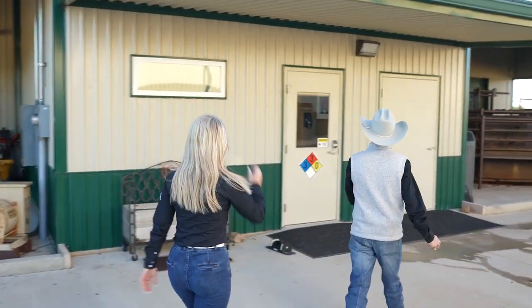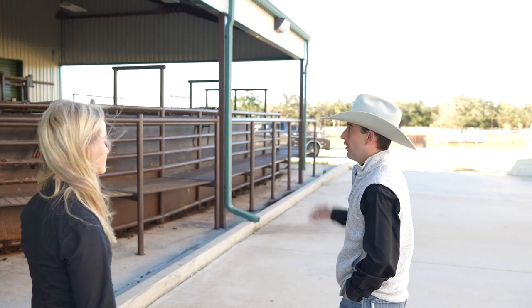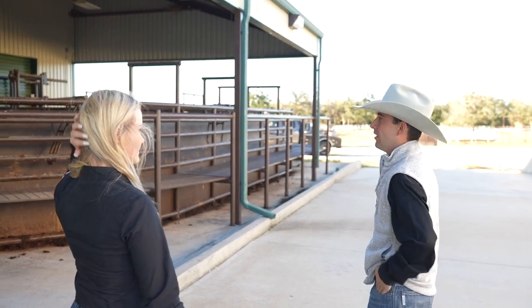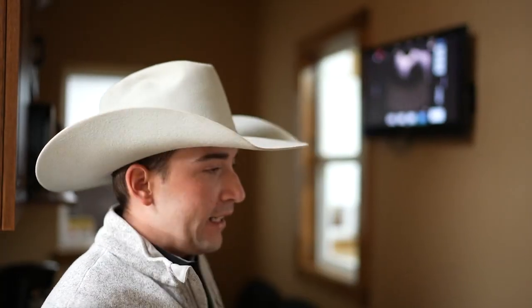So this is the chute barn. This is where cows will get pushed through, and the donors will be lined up back here, or recips for transfer, and then our crew, they'll go into the building, which we're about to walk in there, and that's where we'll perform the IVF procedure on them, or the conventional flushes. Back here, this is the chute barn. This is where we run the donor females through and collect those oocytes.